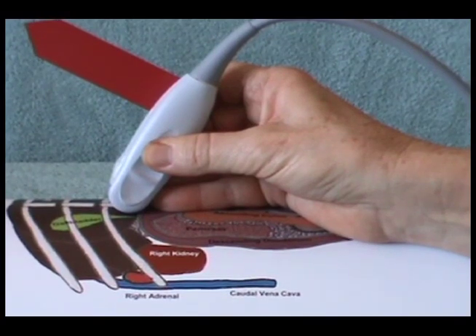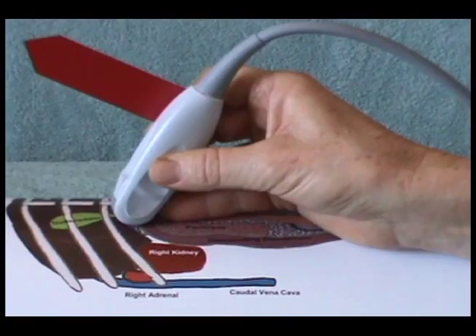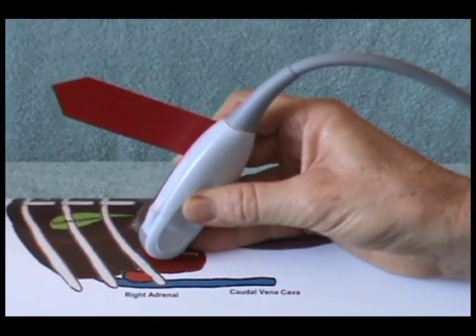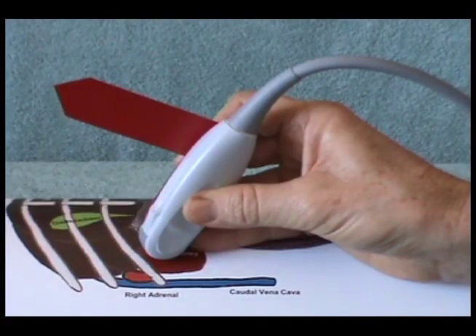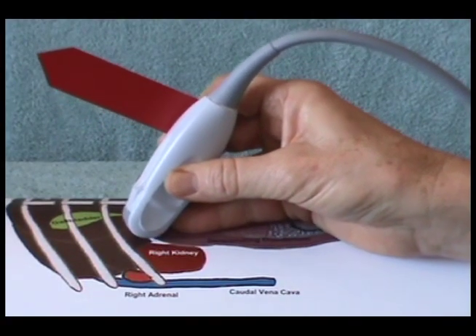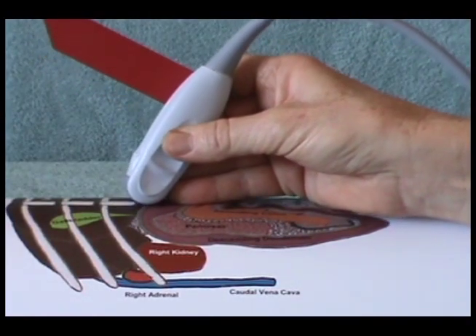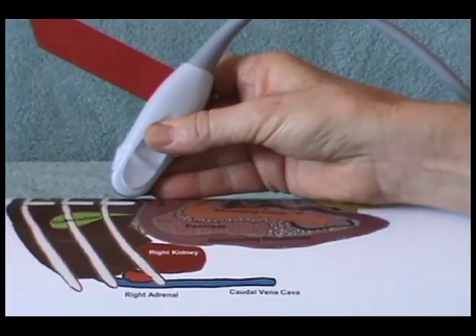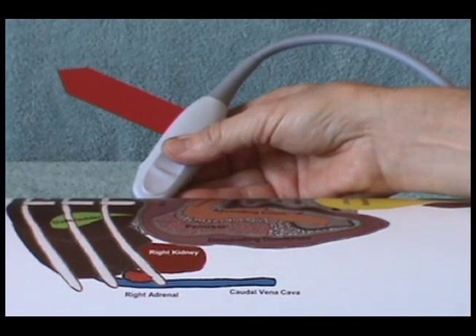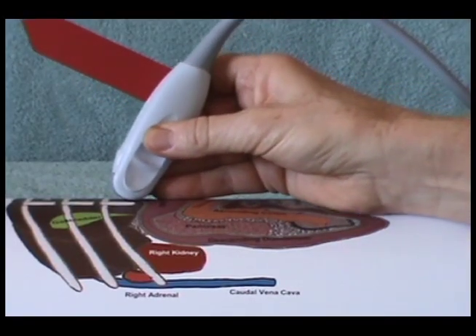Fan or slide the transducer along the last rib to the patient's right side till all of the right liver has been seen. Then reverse directions and fan or slide slowly to the patient's left till all of the left liver has been seen. Return the transducer to the patient's left side of the xiphoid.